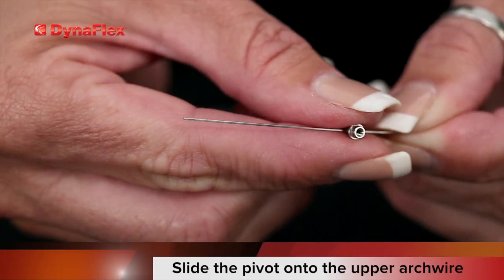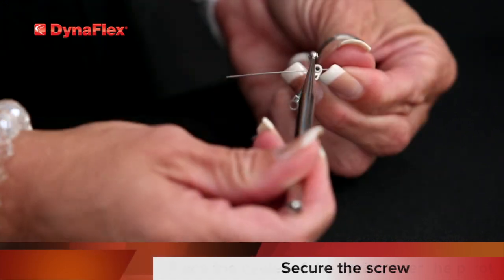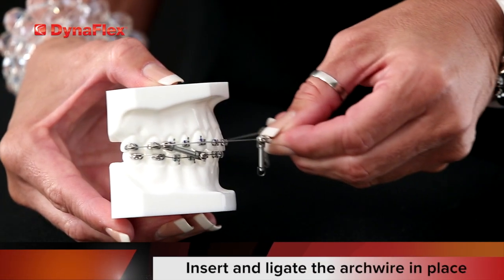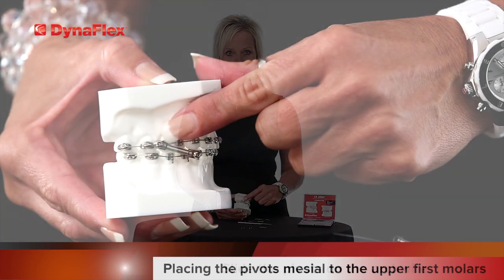For class 3 placement, place the pivot onto the upper arch wire, place the eyelet of the spring over the pivot, and secure in place with the screw. At this time, go ahead and insert and ligate the upper arch wire into place, placing the pivots mesial to the first molars.